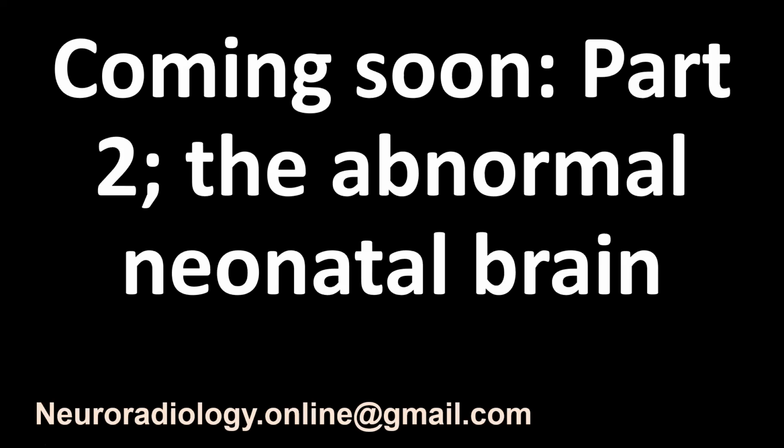I'm going to do some other videos on pathology of the neonatal brain. I find this a very important topic because in order to detect pathology in the neonatal brain, you have to be familiar with what a normal neonatal brain looks like. And I hope I succeeded with this video.